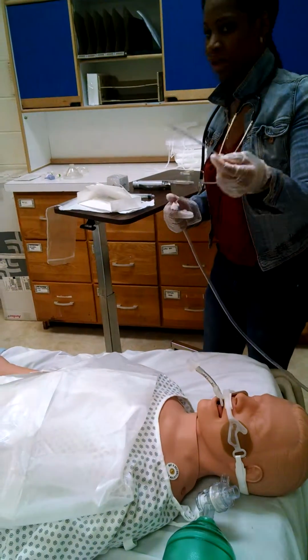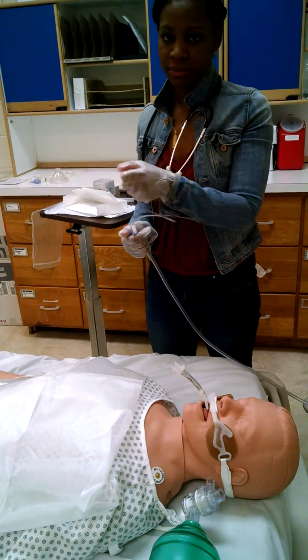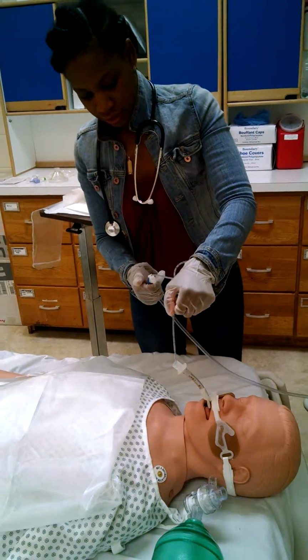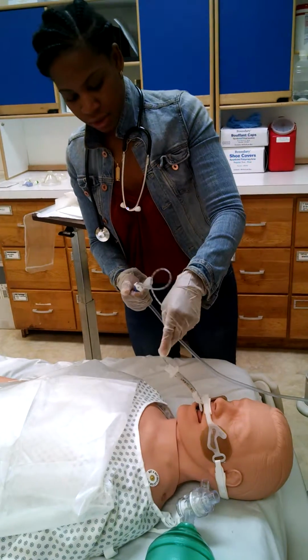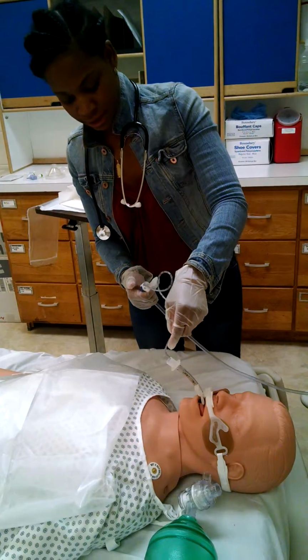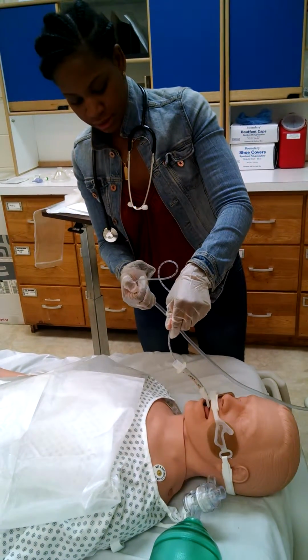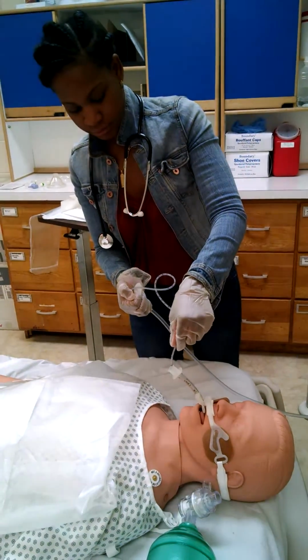And I would have checked to make sure that the suction is working by placing it in the water first before I would suction. Okay, once I hit an obstruction, I'm going to pull back a half an inch, place my thumb on the thumb port, and suction.